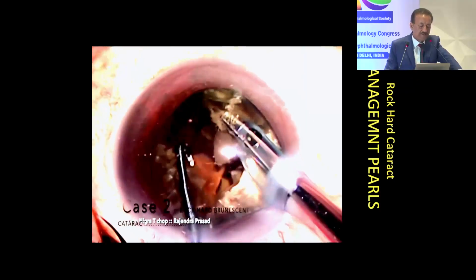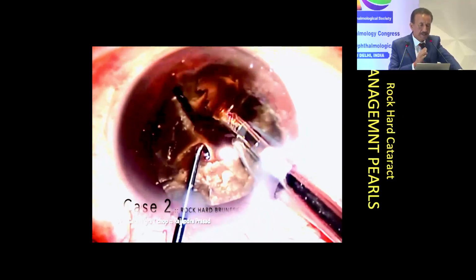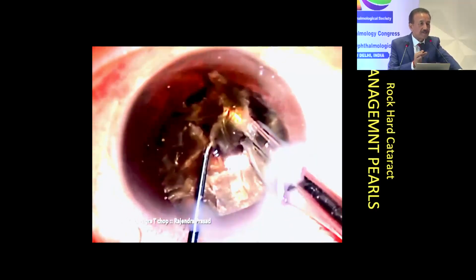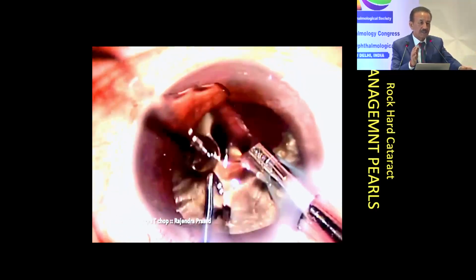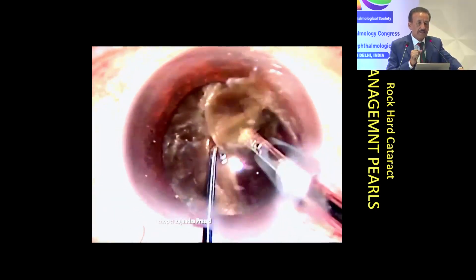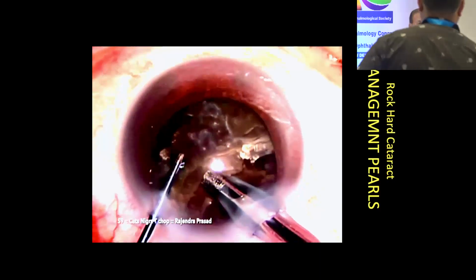Now you are taking the first and see the division of the nucleus as if you have done a femto division of the nucleus, because you get a sharp cut. It's not a cut actually, it's just a sharp crack. Any hard object, when you crack it, cracks into two completely. This is what is happening with this device. This will happen only with this device because it has a wedge, inner edge, and this wedge actually acts as a cracker, and you can complete the surgery in this kind of cataract.